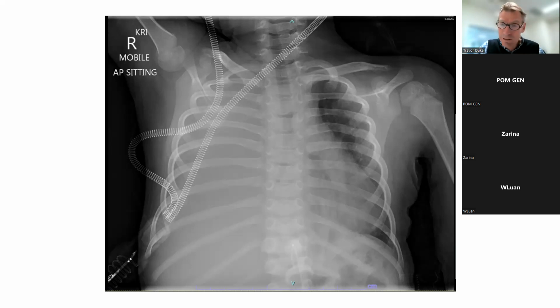If you've got a tumor, say a teratoma or some other tumor of the chest, then you can have an effusion related to that. So it doesn't have to be either one or the other. It could be both. But of course, statistically, it's most likely to be an effusion, isn't it? Because effusions are much more common than chest masses.